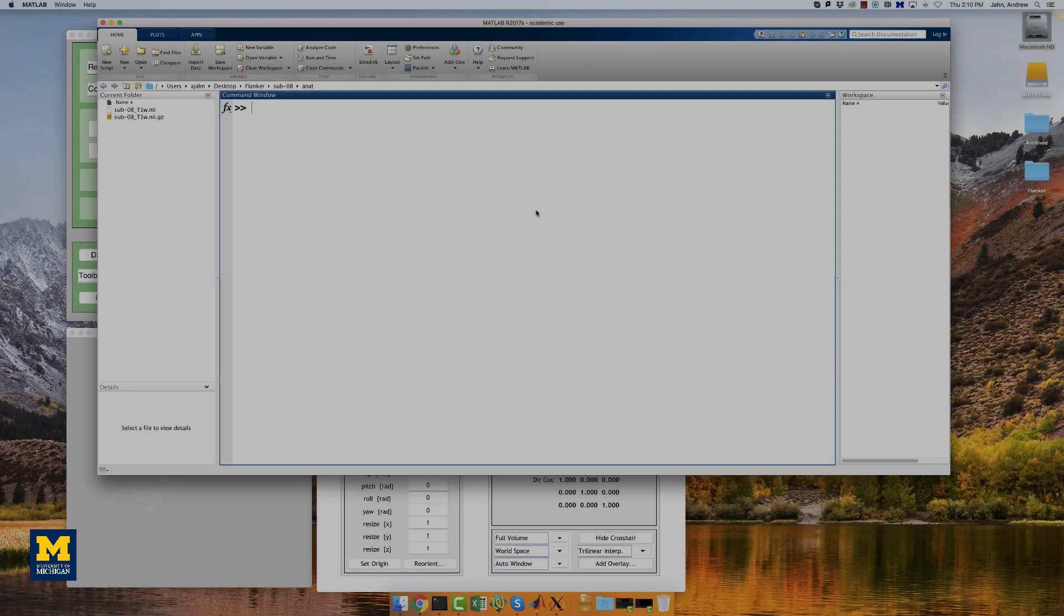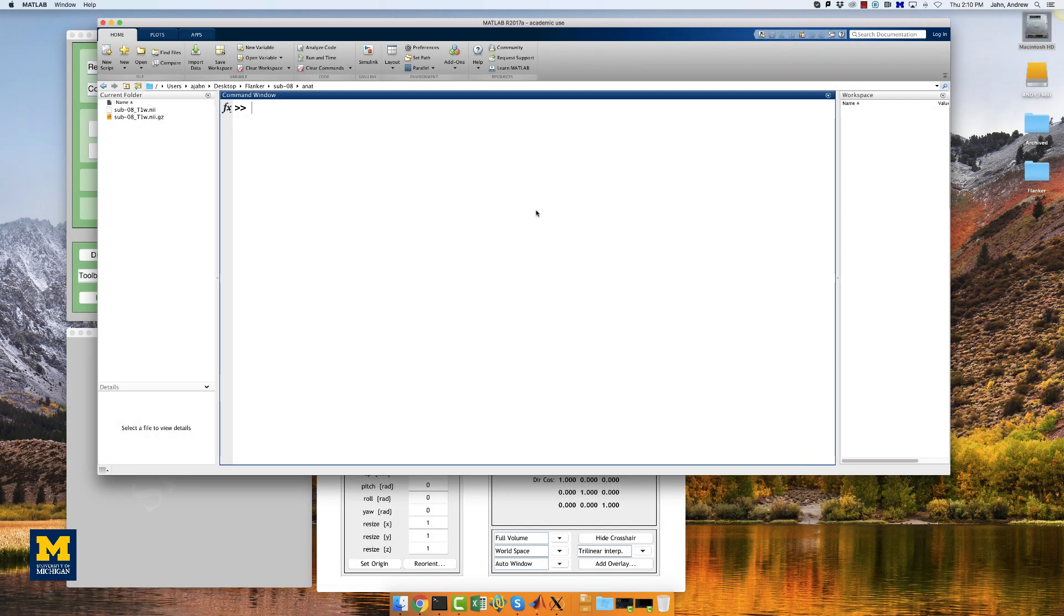To begin, open a MATLAB terminal, make sure SPM is open, and then navigate to the sub 08 folder within the flanker directory.